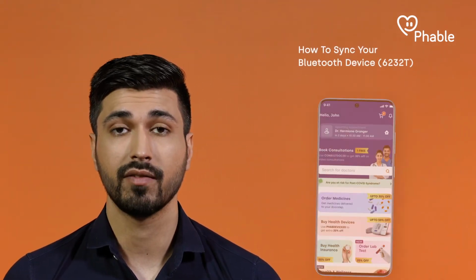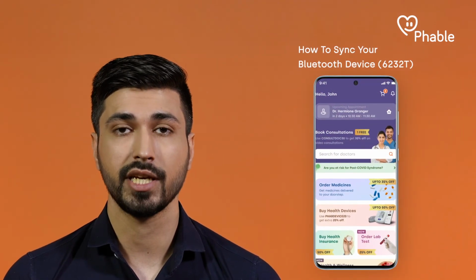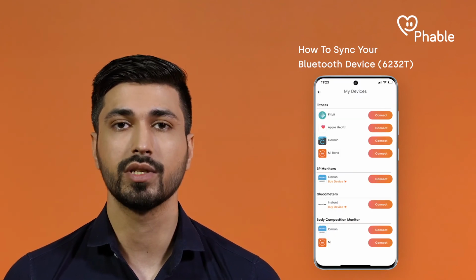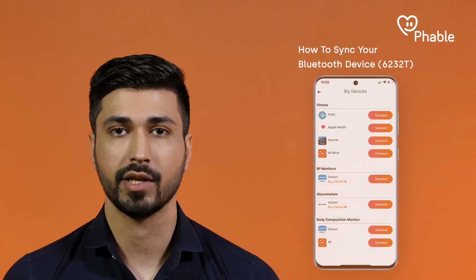If you have a Bluetooth device like the Omron HEM 6232T, you can pair it with the Phable app using the My Devices screen from the main menu. To track and sync your readings, install and open the Omron Connect app.